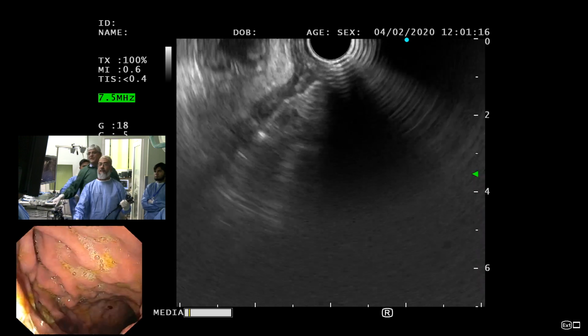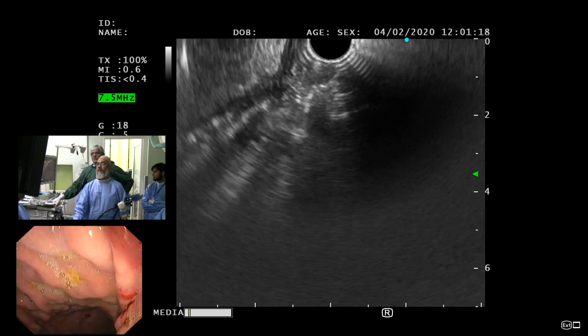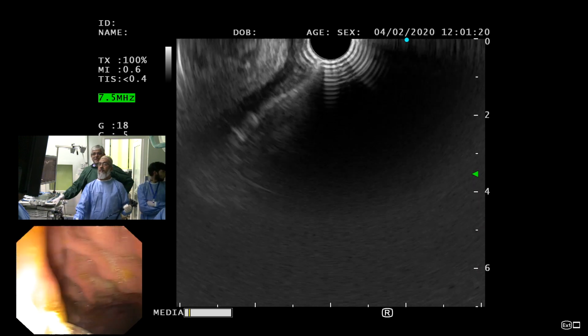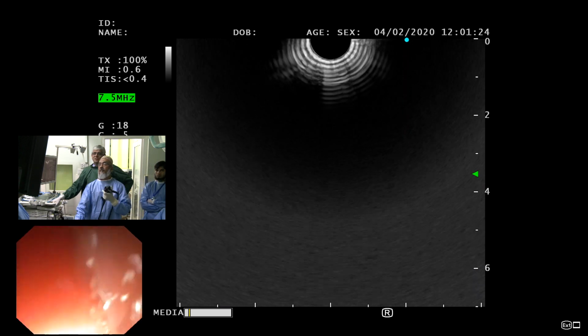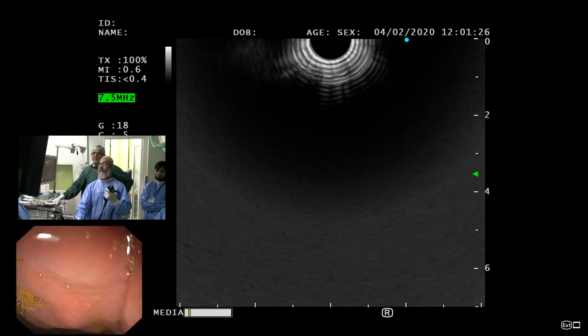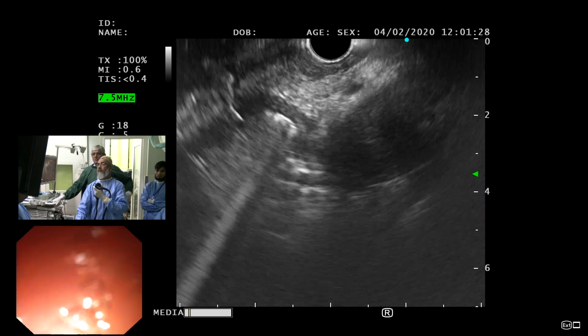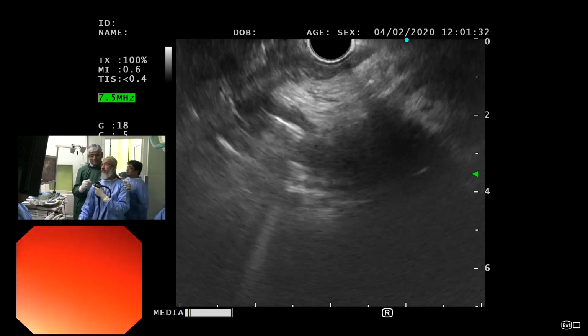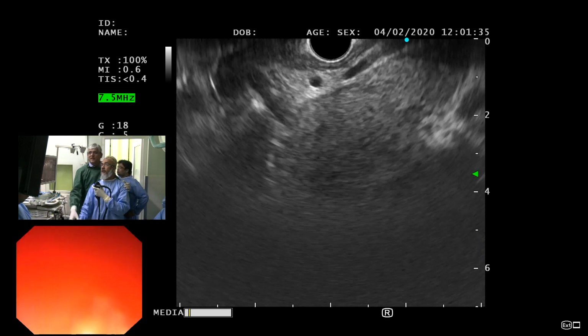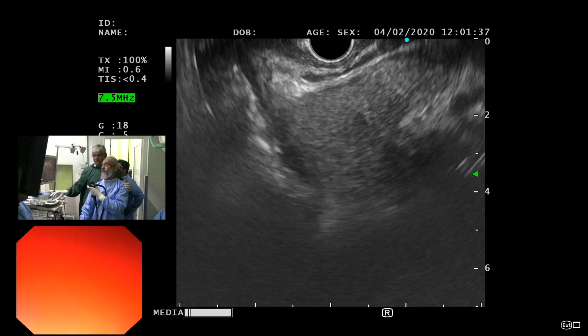This patient has been delayed by the time she has been referred to us, because this stent was placed in October. So I assume that when they... so now you bring the liver. So let's focus on what we are going to do. So tip up. Yeah, tip should be up. Okay, and where are we?